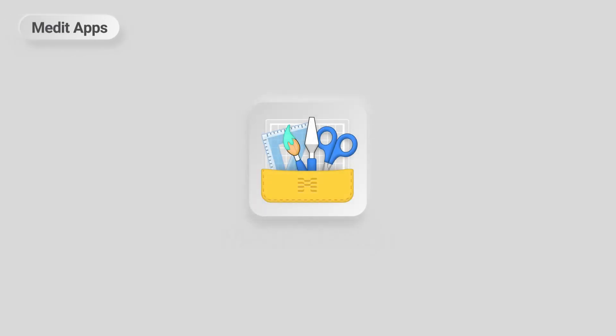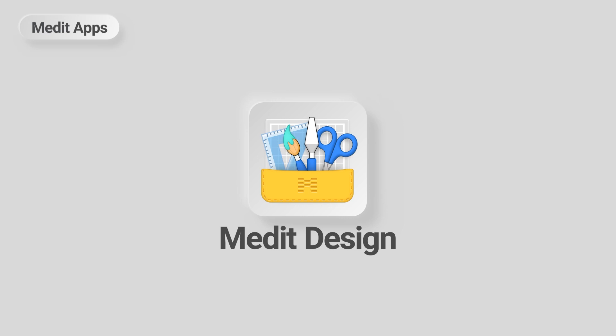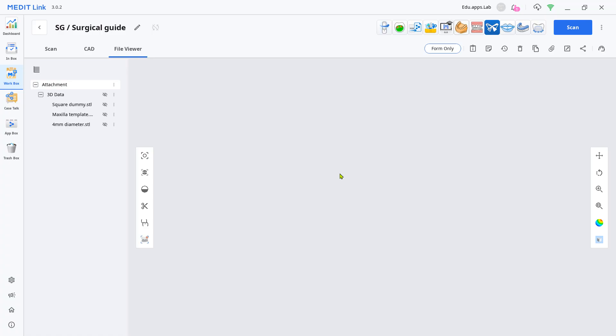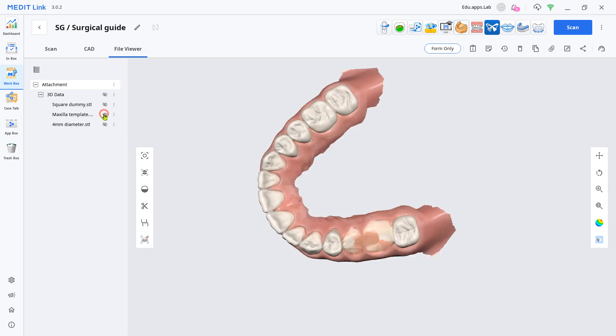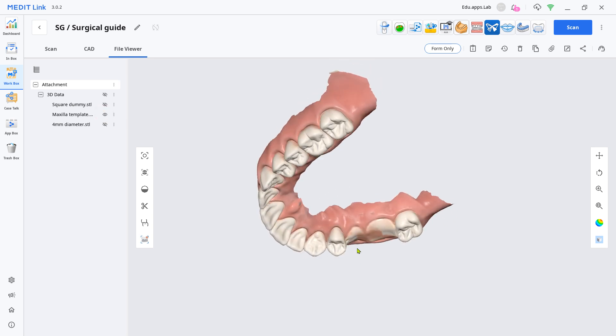This is a quick demonstration on how to design a non-sleeve-type simple surgical guide with the Design App. Normally, the surgical guide has to be planned and designed with DICOM information, so please note that this demo represents only one possibility of the Design App.